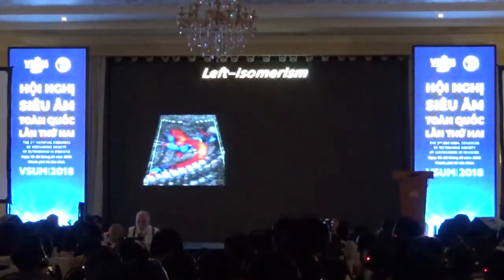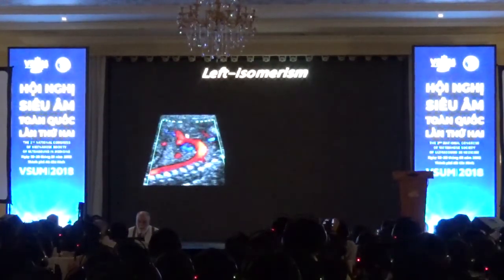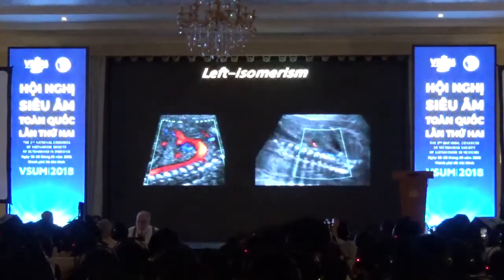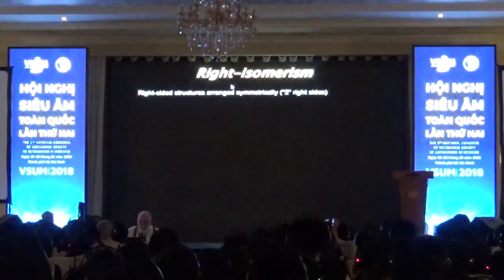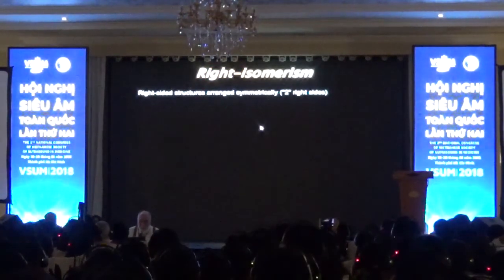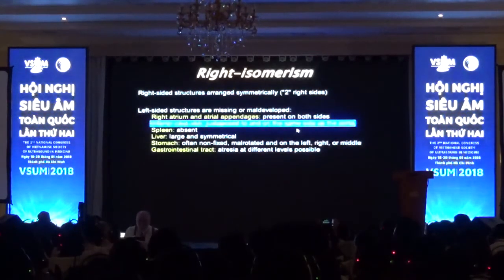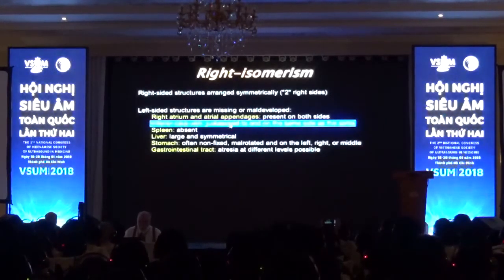And when you do Doppler, you see this is the azygos arch. You see the blood is going from the back to the front. This is the azygos arch, the image I showed you yesterday. And you can see the two vessels inside the chest. Now, the right isomerism, you have a baby that has two right sides. So the inferior cava, instead of being in the normal position, is going to be in front of the aorta, on the same side as the aorta. This is very classical. If you find a juxtaposed aorta and IVC, this is a baby that has right isomerism.